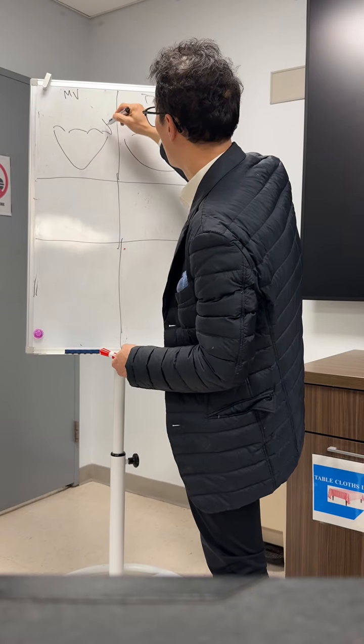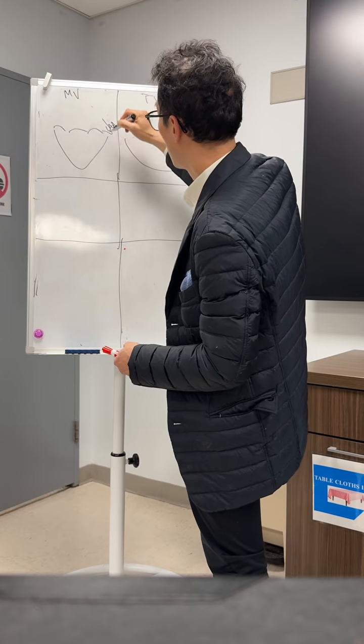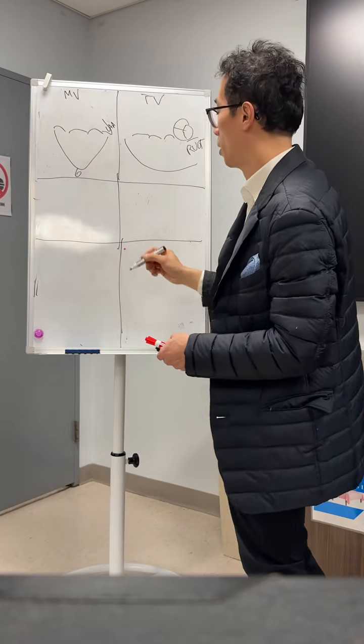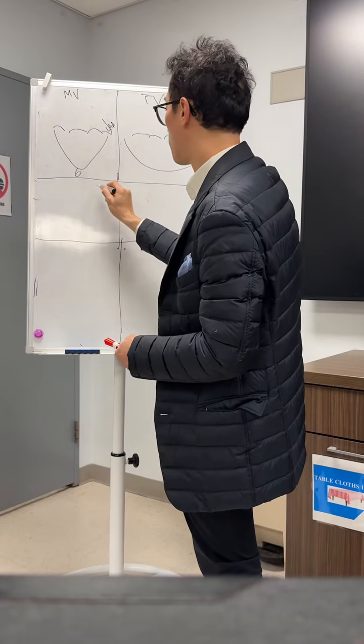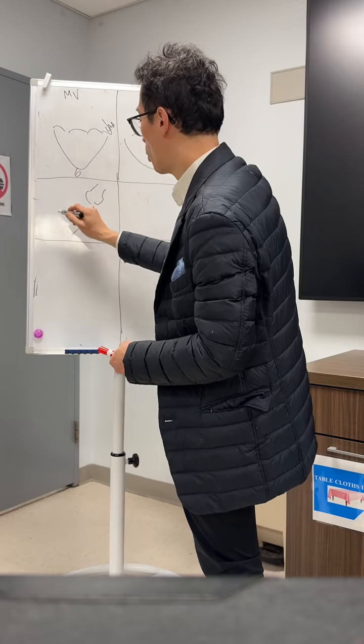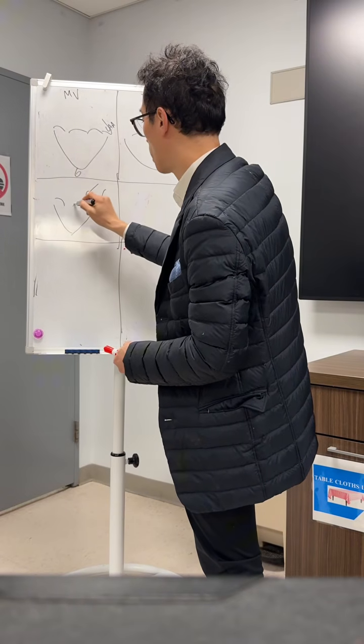This is the LAA here roughly, this is at 6 o'clock, and then you can have your device. So here, your orientation, let's say, is already checked, is optimized, you're ready to go for your grasping.